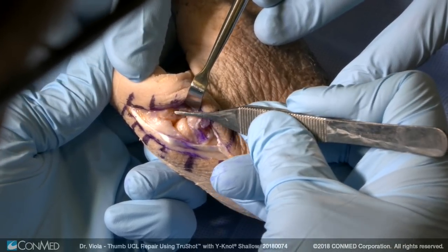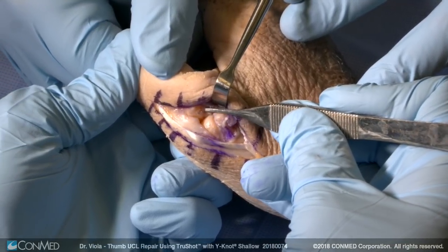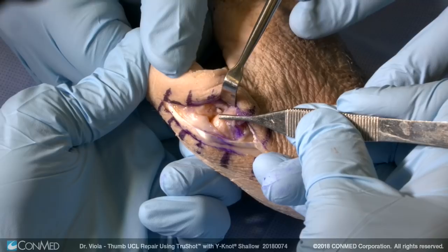Here's the dorsal surface of the bone. The normal insertion site is at the junction of the middle one-third of the base of the proximal phalanx and the volar one-third.